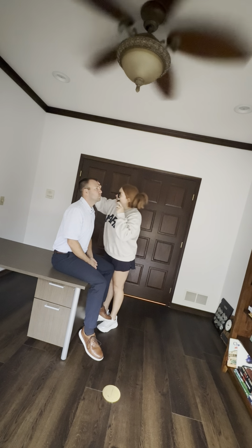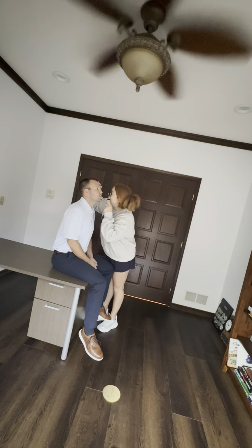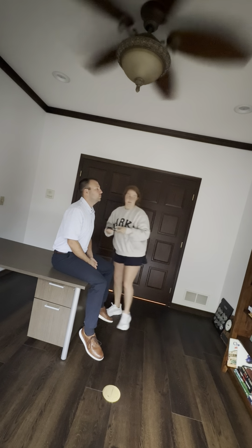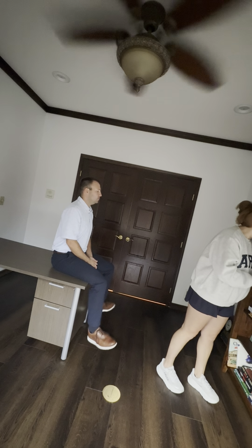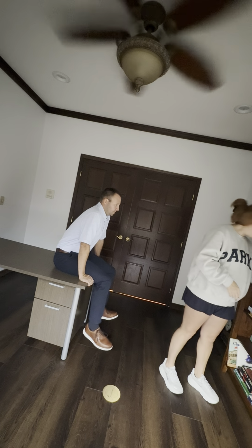Find it again. This is just looking at the back of your eye. Okay, very good. I can see your optic disc, and then your veins and your arteries. Everything looks normal. There's no hemorrhage or abnormal coloration. It looks nice and kind of a creamy yellow back there.